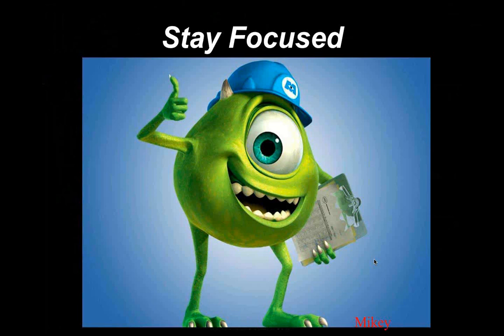16, again, 16, 16.5, 17, those are really good places to start on these lenses. And you need fitting sets up through 18, or at least to 18, to be able to do this properly. And do yourself a favor, when you think you've got a good fit, for example, in a 16.0, take the extra couple of minutes and put an 18.0 on also, and just look at it. It may look worse, it may look better, but you'll learn something from it. All right, very good.